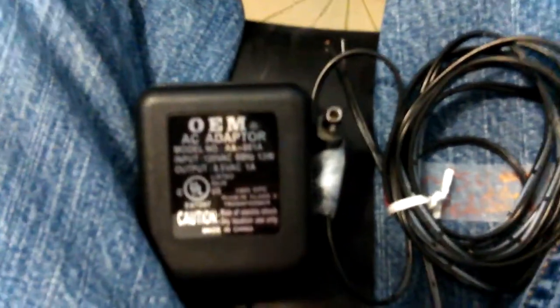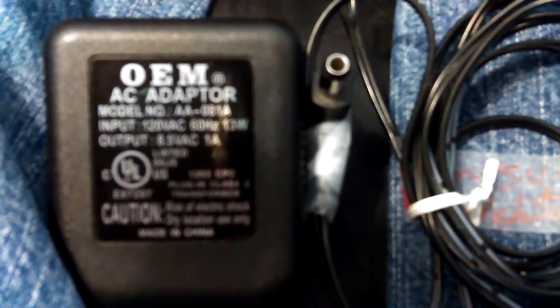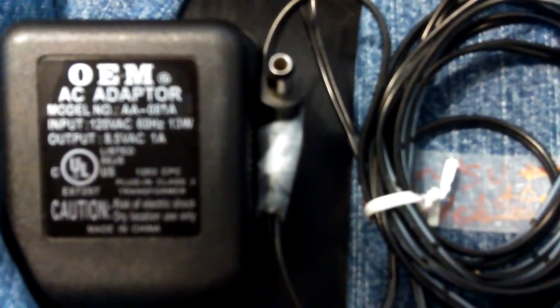Hey, Dawn here. This is Mom's AC adapter for her weighing machine in her room — the one that has a phone line connection where it used to fax stuff into the outfit. I can't remember the name of the outfit.